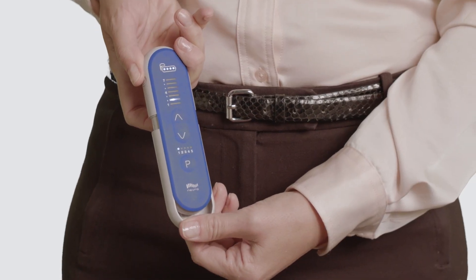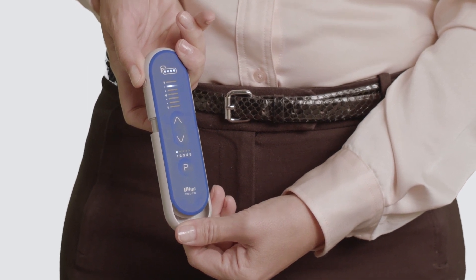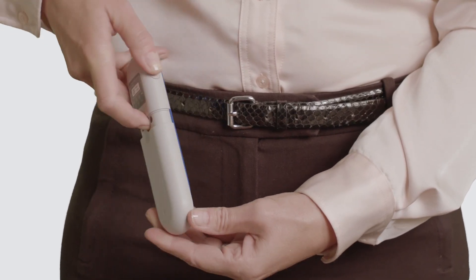Continue holding the red stimulation off button. The illuminated numbered levels will then begin to light up from bottom to top, indicating the impedance check is in process. The remote will then beep when the impedance check is complete. Once you hear the beep, you can release the red stimulation off button.